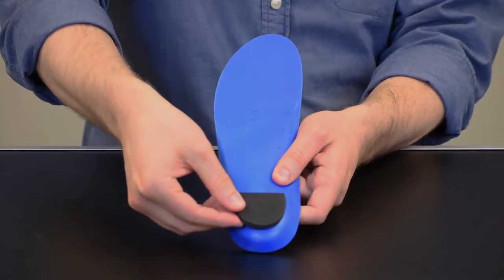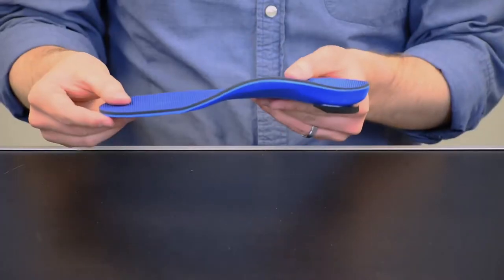Application is just like the heel wedges. Remove the backing, apply firmly to the underside of the heel, and adjust to comfort.